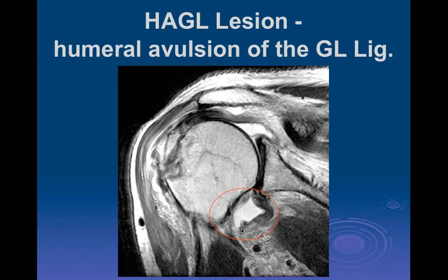I'll give you that. I'm not so concerned about that. Oh, and then coming over to the labrum, I think it's been ripped off and is going down inferiorly because it looks like there's some abnormal... Right there, exactly. I thought that was a torn labrum that's being extruded, no?